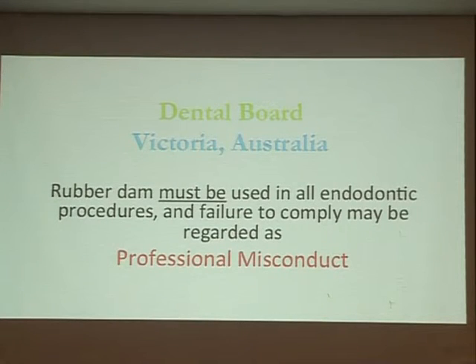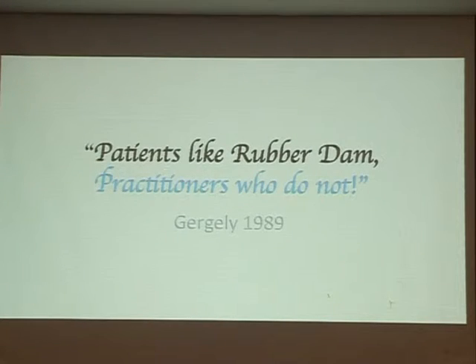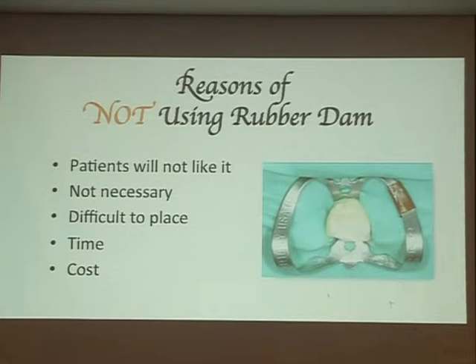Okay, it's very strict. There's a study saying patients like rubber dam, but the dentists do not like it. There are a few reasons. Dentists responded to a survey on why they do not use rubber dam. Patients do not like it, but dentists don't give the patient a choice. They think it's not necessary, they think they can do it without. Difficult to use, time and cost.